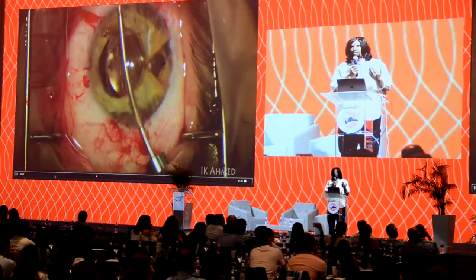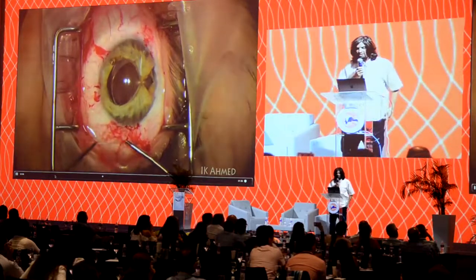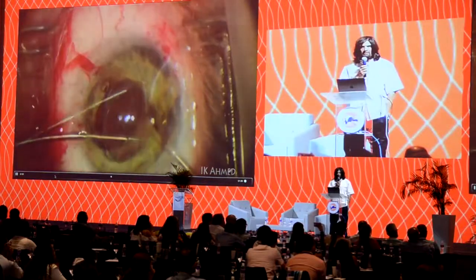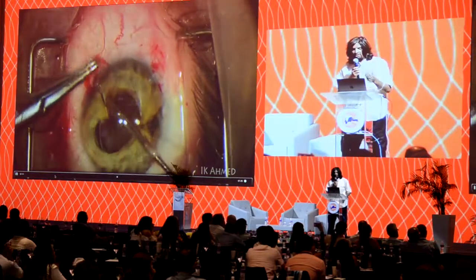We have a lot of these videos on my YouTube channel and on YouTube. Others have published different ways and different techniques, but this is to me, after training residents and fellows over many years, training with other techniques, this truly, in my opinion, and then using a micro scissor to cut rather than a big scissor, is helpful.